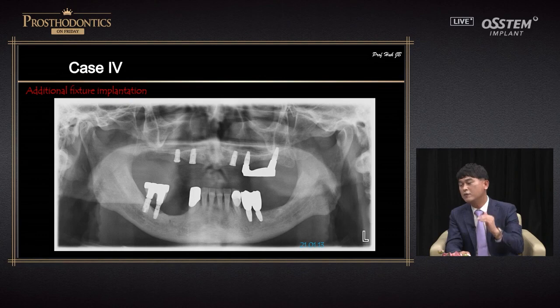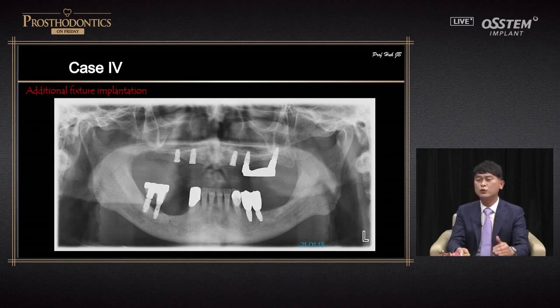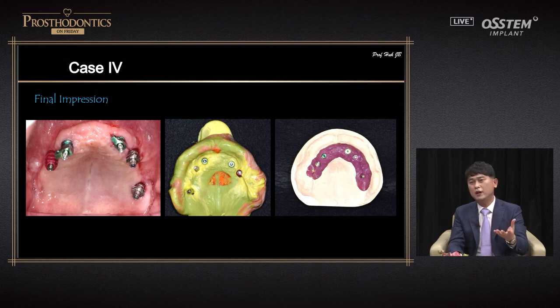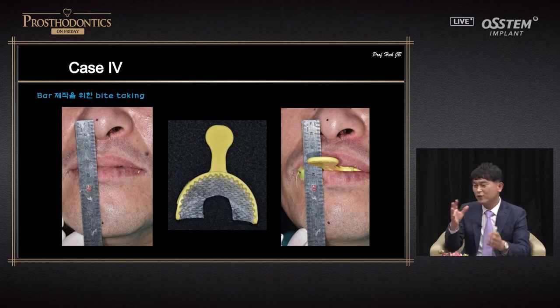But one good thing is the mandible is RPD. We need to look at opposing teeth. If they are very strong, 5 implants will not work. Even with all-on-4, for Koreans, if you do not balance the force, it will break down. You have to check the balance of force, and first I took the pickup impression, and the patient is complaining a lot.